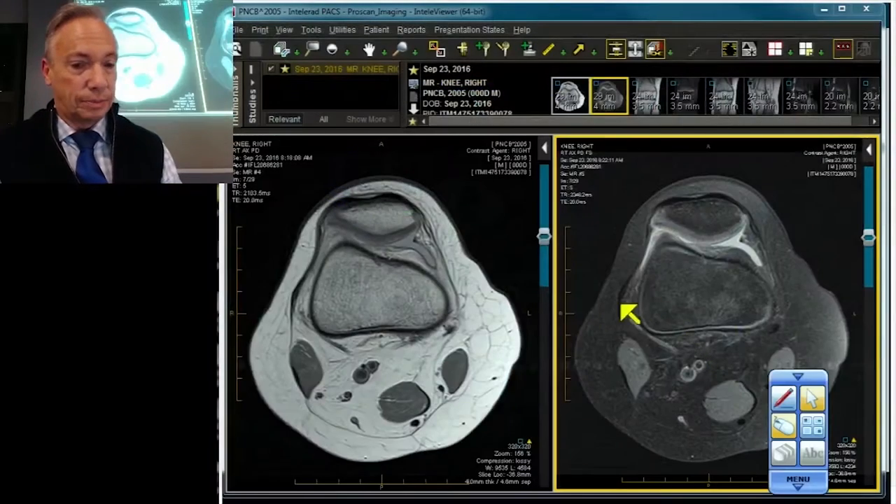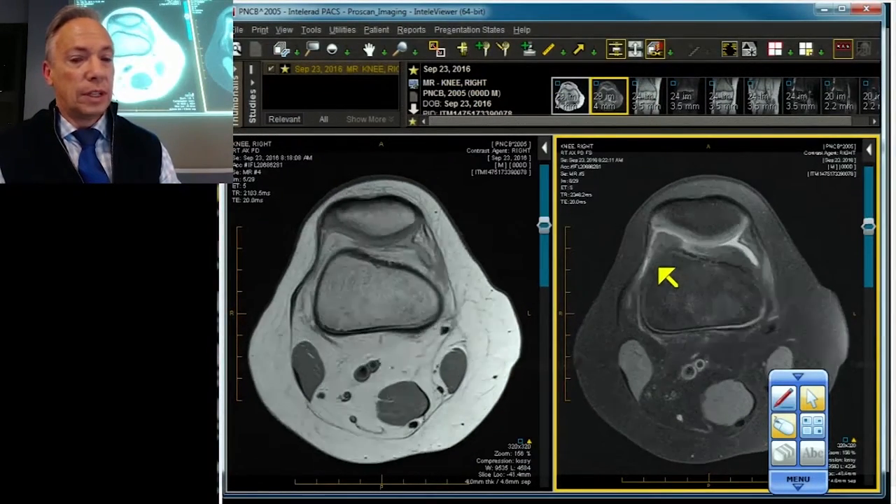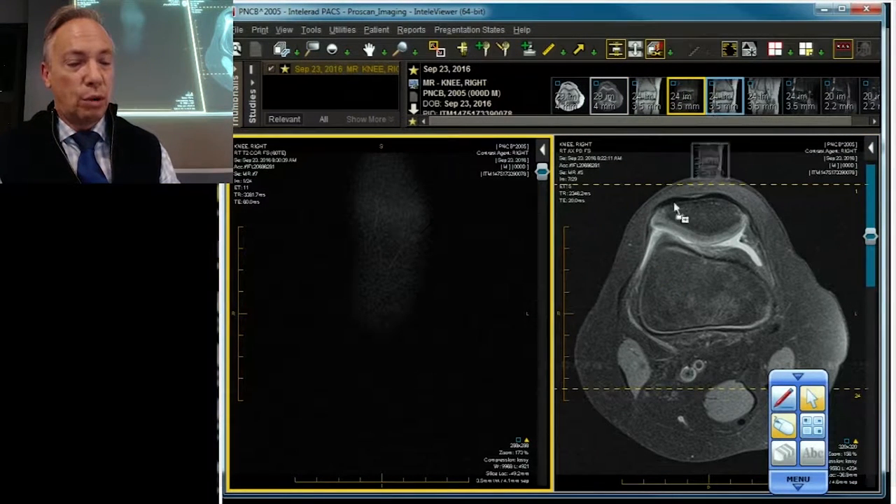So now let's go to our case. It's a kitty cat — it's a child. There's a little bit of an effusion. Let's go right to the heart of the matter. Let's put up our coronal projection.